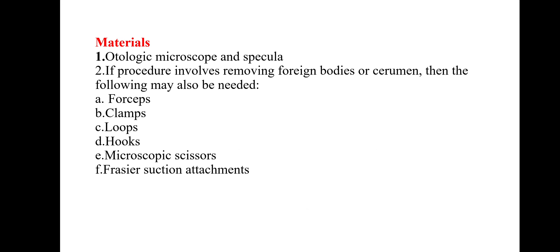Materials required: otologic microscope and specula. If the procedure involves removing foreign bodies or cerumen, then the following may also be needed: forceps, clamps, loops, hooks, microscopic scissors, and Frasier suction attachments.